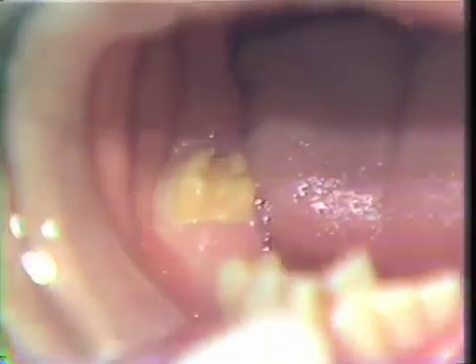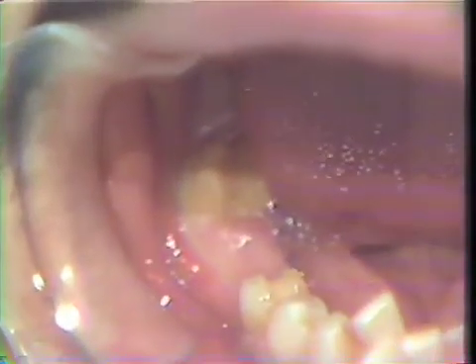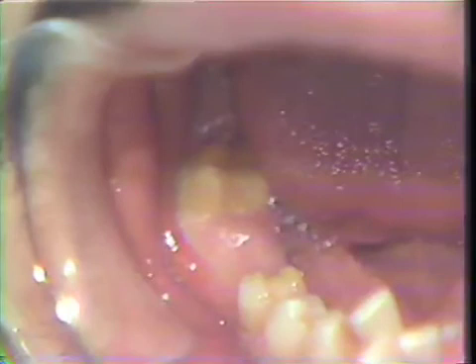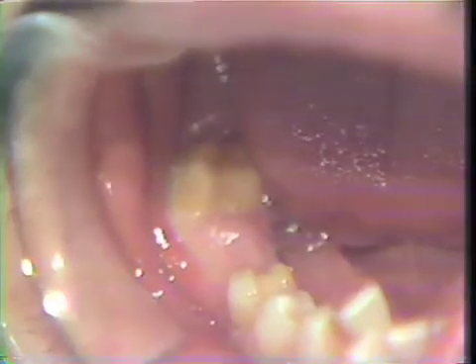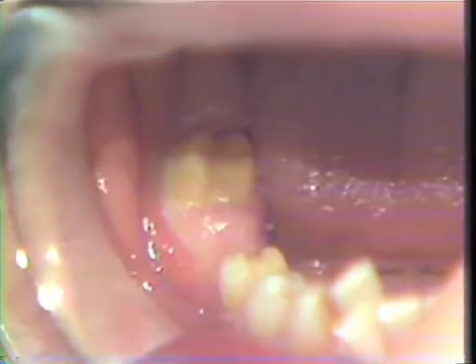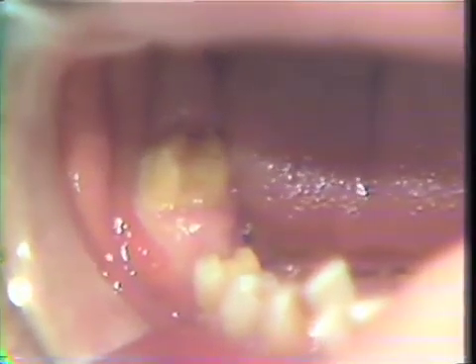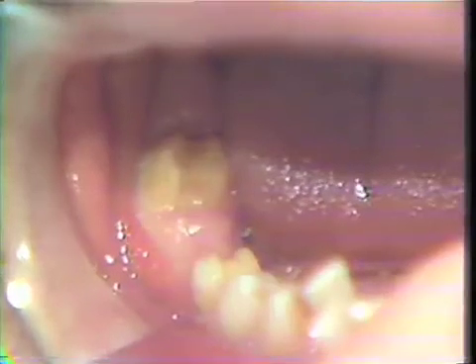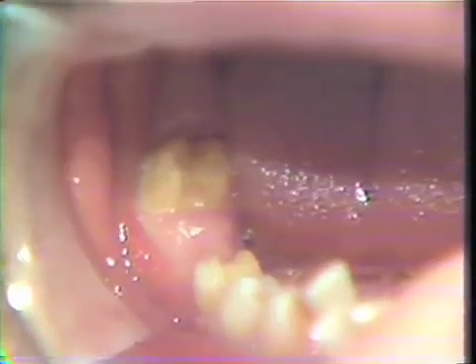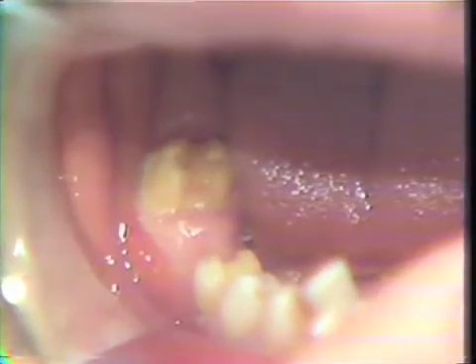We have a full crown on the molar abutment and a 3/4 crown on the anterior bicuspid. We have lubricated the soft tissue on the teeth with a sterile Vaseline material to eliminate any possible contact with the soft tissue and the acrylic material. And we're now ready to mix up our acrylic and fabricate our platform prior to the functional chew-in.